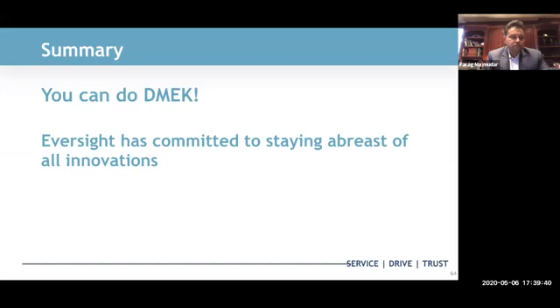Okay. Next question from Dr. Jennifer Park. Do you rebubble with air or SF6? So in the clinic, I do have a container of SF6, and I usually try to keep it stocked because I like the fact that SF6 provides a little bit longer duration of the bubble, on the order of 1 to 3 days for air versus maybe 4 to 5 days potentially with SF6. So I usually rebubble with SF6.